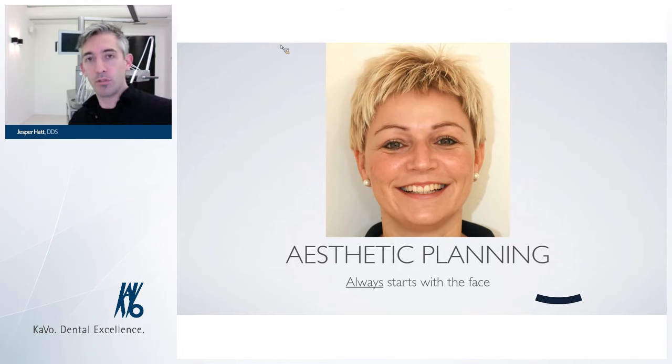So this patient I'm going to use just to show you how we plan our cases and why we do it the way we do. So first of all, we look at this patient and we take notice of the different facial characteristics. And when we look at the face here, it looks as if the eyes are in a different plane, the ears are different, the smile is kind of candid, and right now we don't know if it's because the head is tilted or if the camera was positioned in a different position.